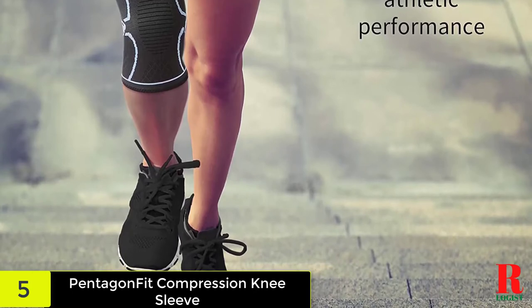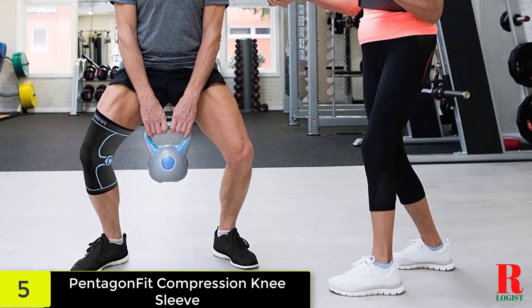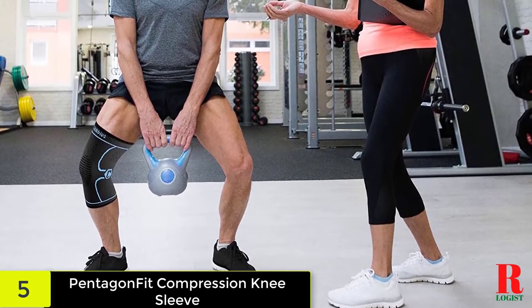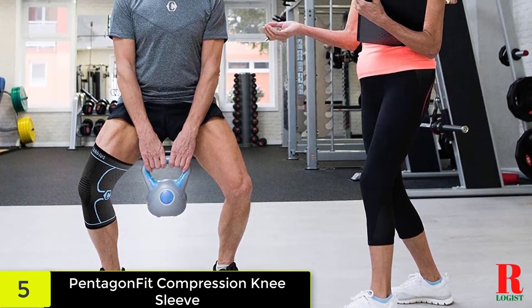Cleaning and maintaining the knee sleeve is simple. While you cannot machine wash or dry it, you can wipe down the material. Use a non-abrasive soap and warm water to clean the brace, then air dry for an hour or two. This will leave your knee sleeve fresh for many more uses.